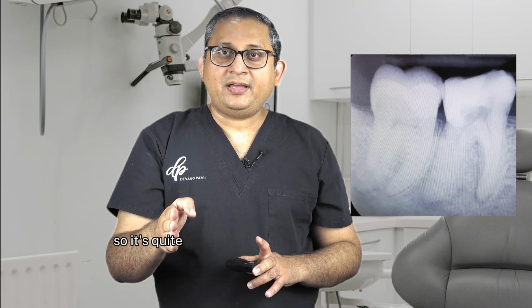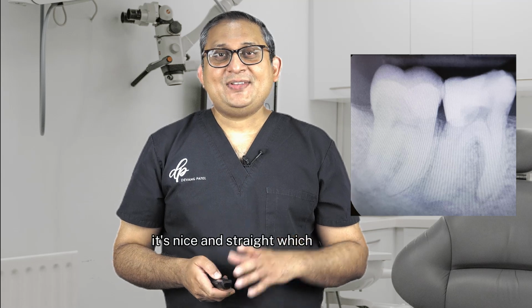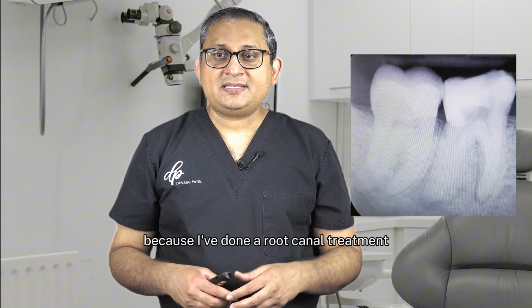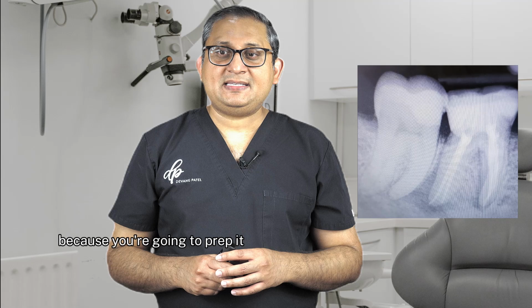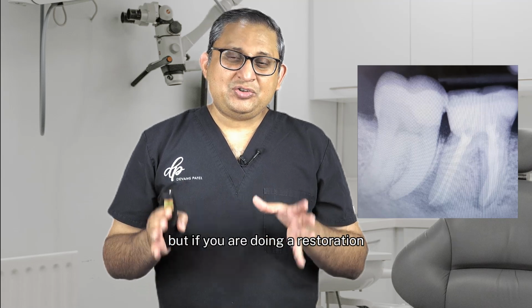So it's quite nice and not really curved. It's nice and straight, which is not ideal. But this tooth was going for an onlay because I've done a root canal treatment, and now preparing for onlay. And that's the reason you could afford to have that, because you're going to prep it down and then make an onlay for that. But if you are doing a restoration, you need to be aware of it.